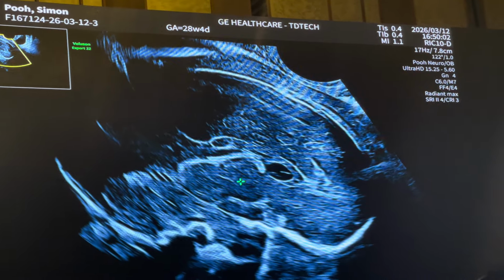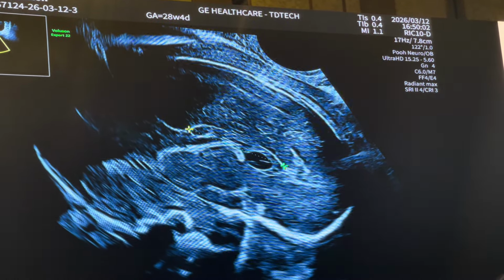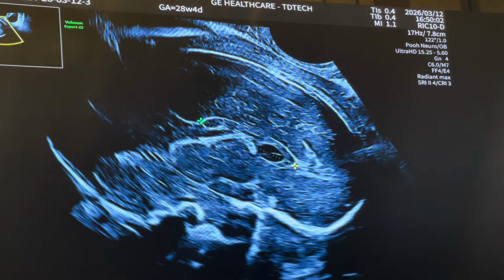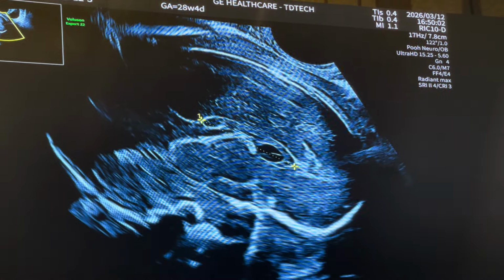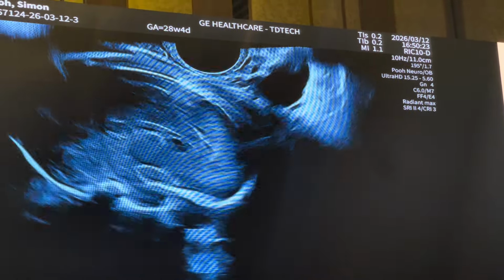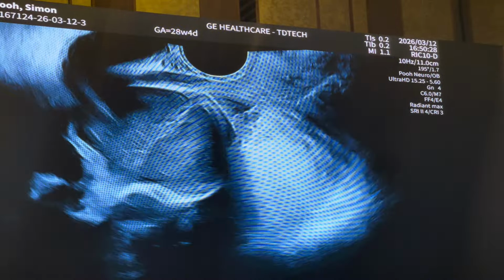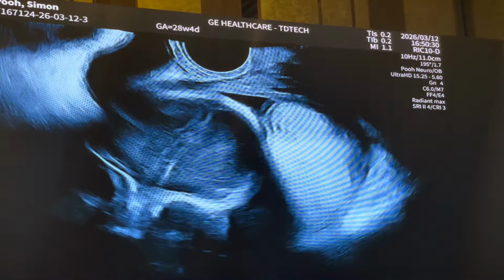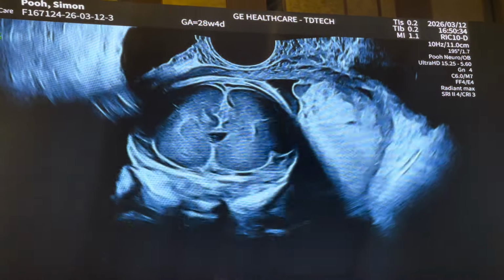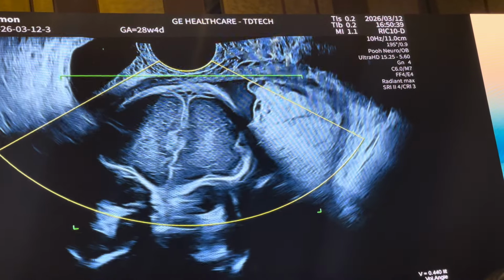So this is where we now want to chart the corpus callosum. We see the rostrum, the genu, the body. We have not seen the splenium yet, but we'll come back to this. That's 28 millimeters. And now we can measure the distance between the occiput and the sinciput, the occipitofrontal diameter. But the good news in this case is that we have seen that the corpus callosum is present. We can see the cavum septum pellucidum is triangular in shape.